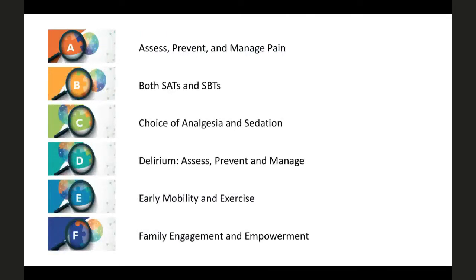In intensive care practice, we take care of the A, B, C, D, E, F bundle. Pain management is definitely there. Spontaneous awakening trials and spontaneous breathing trials are there, which we'll discuss further. Choice of analgesia, sedation, delirium management, early mobilization, of course, family engagement and empowerment, everything taken together will produce a good package of intensive care management, especially when mechanical ventilation is involved.